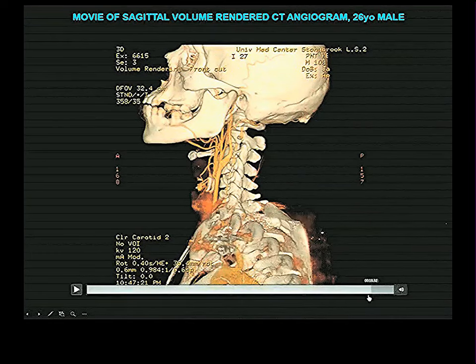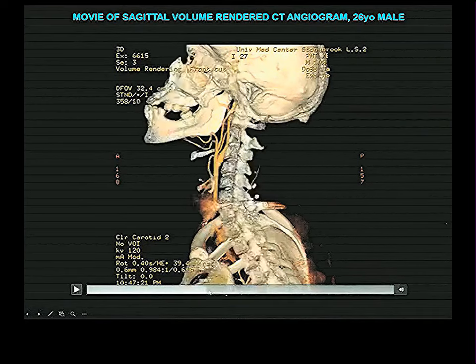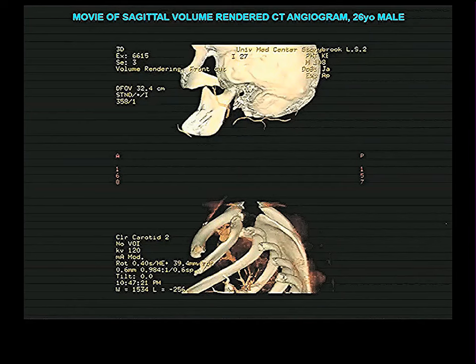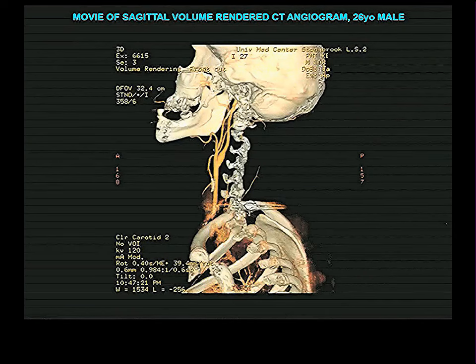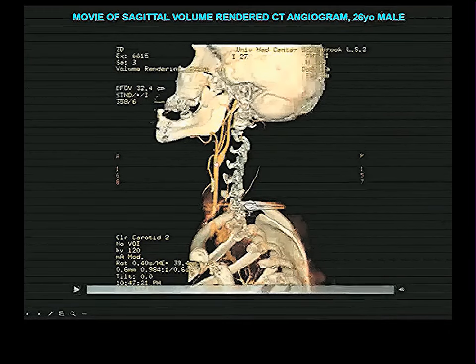So let's go back to where we're just looking at the person's left. Here, we're all the way, I'm sorry, person's right. We're all the way to the right of this individual, to the individual's right side. And I'm going to come slightly to the left until we see the carotid vessels. And we can see some interesting things here. Here's, first of all, the region of the carotid sinus. You can see the dilatation quite clearly in the internal. Here's the external carotid there.